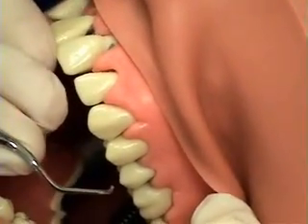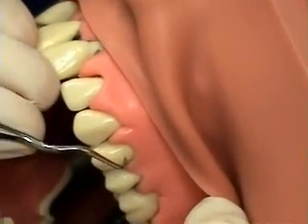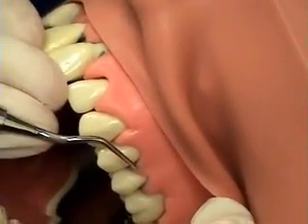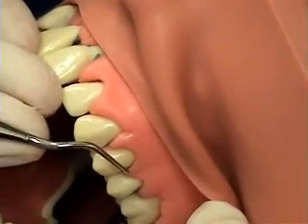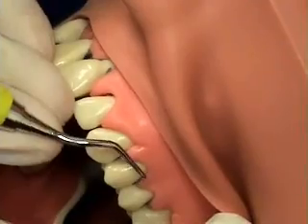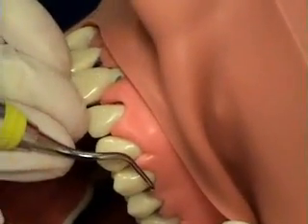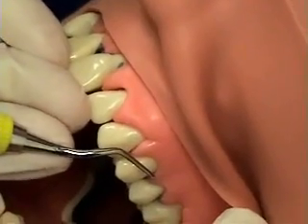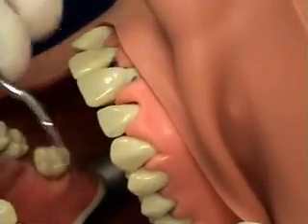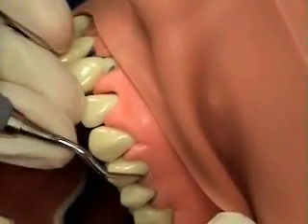Notice how, if you have the incorrect working end adapted, it can look like it's hugging the tooth — but look at the relationship of the terminal shank to the tooth. There's no way you could get that properly adapted because you have the trailing blade as opposed to the correct cutting edge. So even though it looks like it's hugging, it's not correct unless you see parallelism of the lower shank.